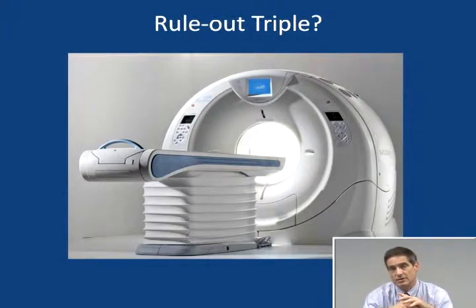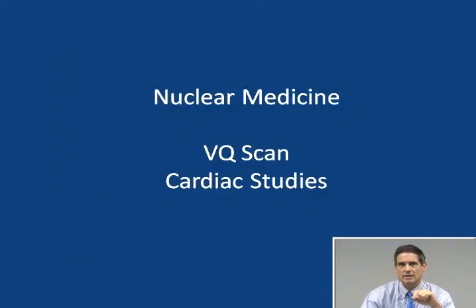Although as this technology evolves, we're probably not too far off from doing that. And as that happens, I think this is probably going to revolutionize the way emergency room medicine is practiced in terms of taking care of chest pain patients and imaging those patients.